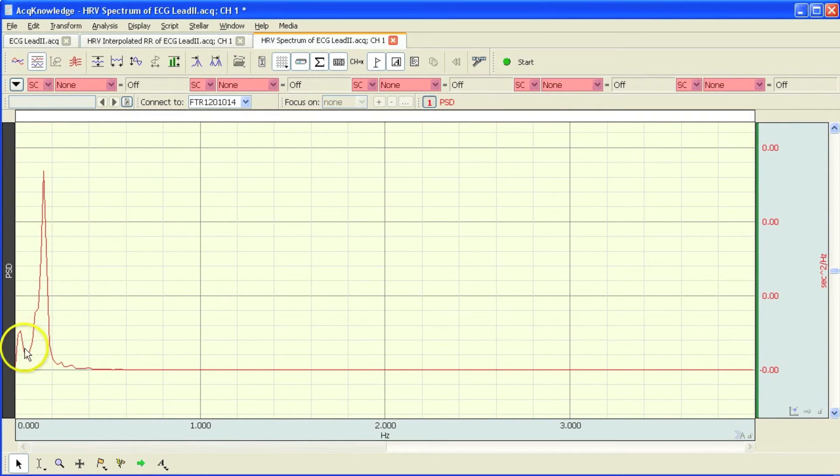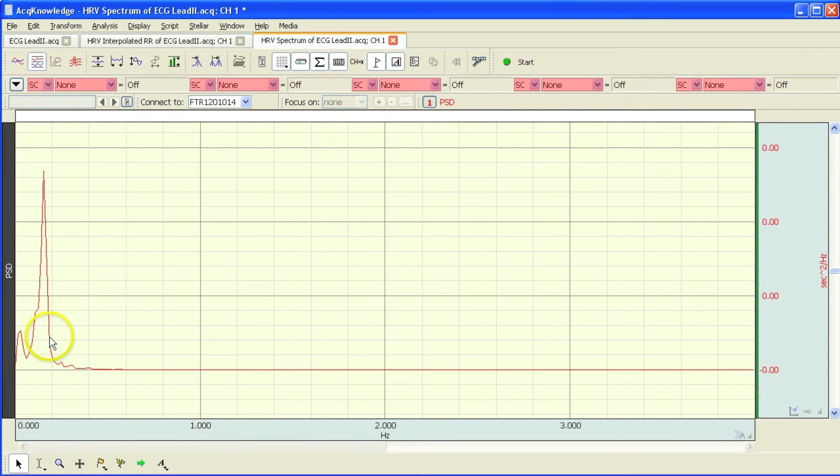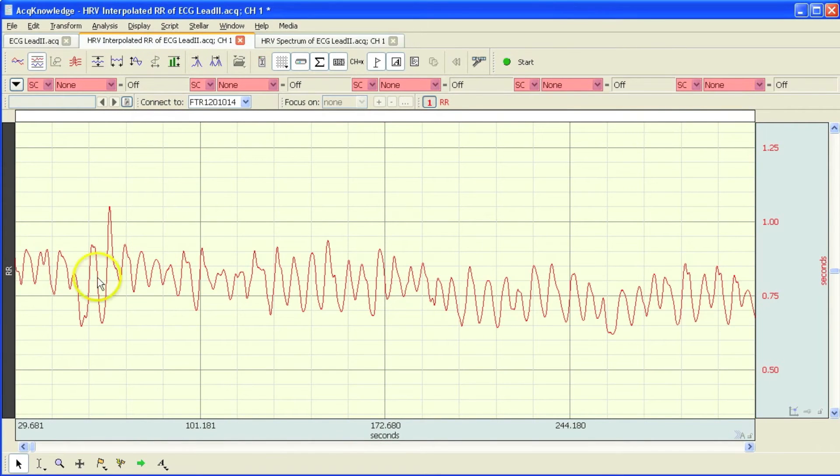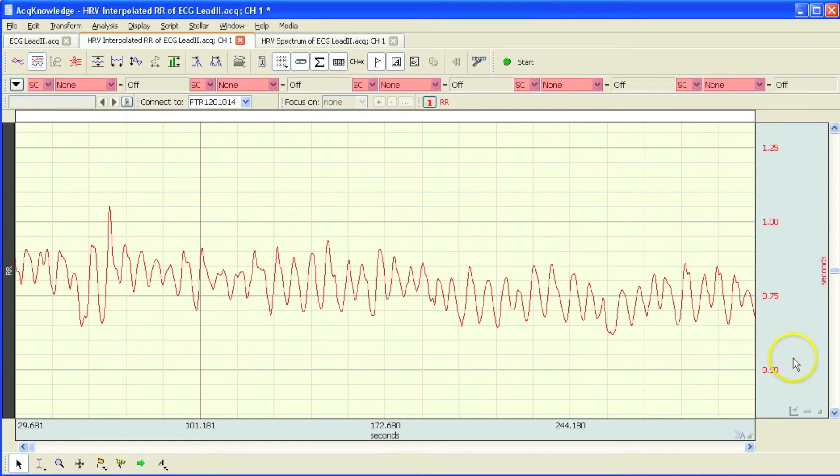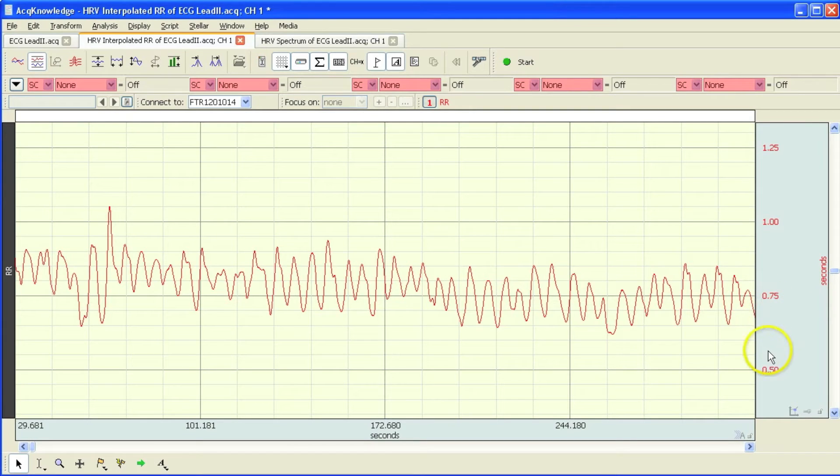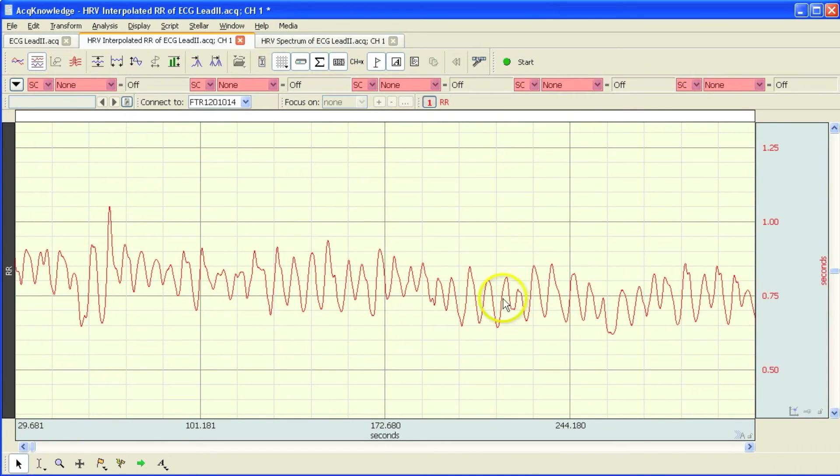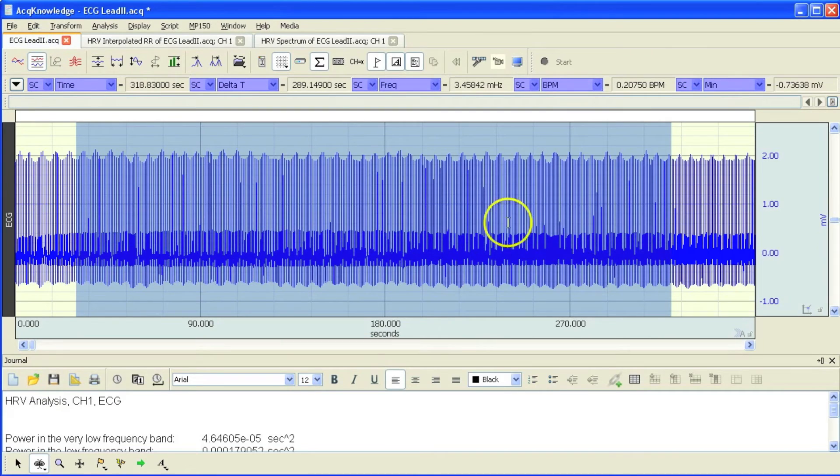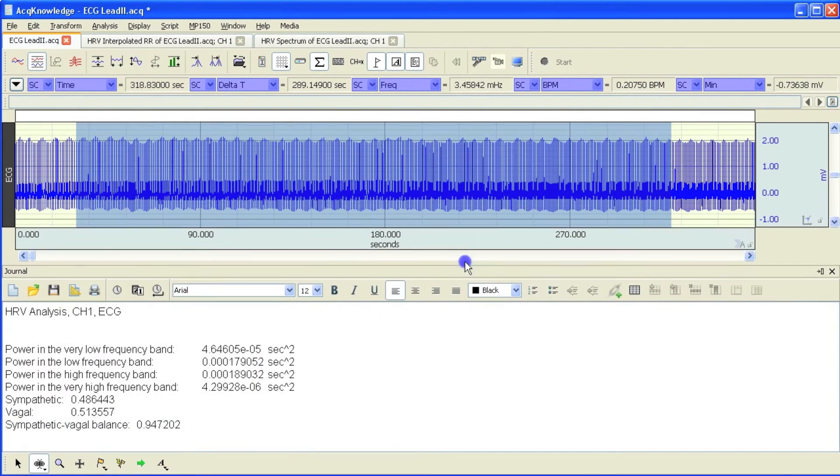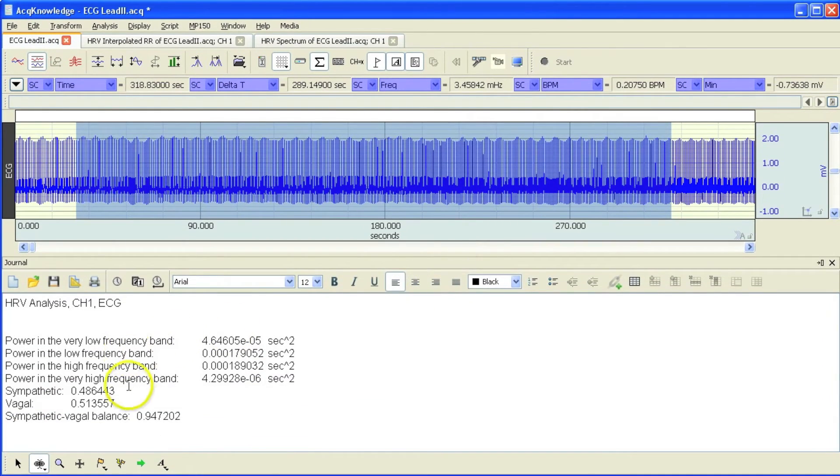This is my power spectral density graph. And here is the interpolated tachogram. So this is each of the R to R intervals for that particular waveform. In the vertical display, you can see we're displaying the data in seconds. So around about three quarters of a second or 750 milliseconds. And then this is our original raw data. And down below, I selected to paste my values down into the journal.